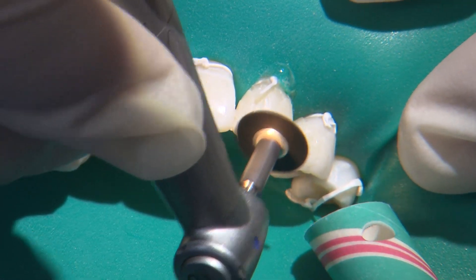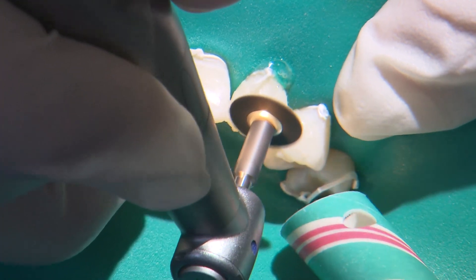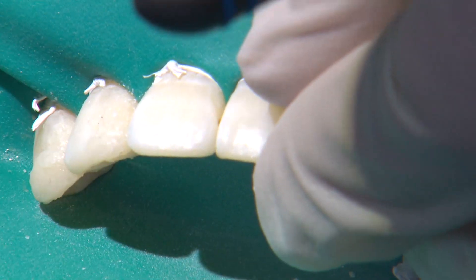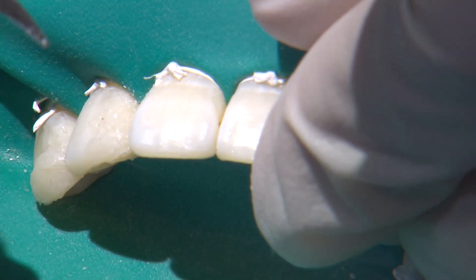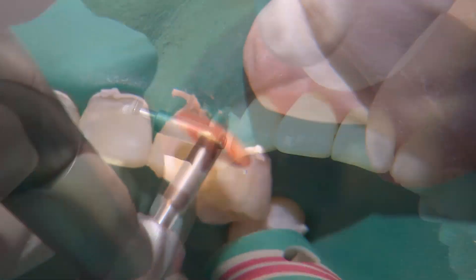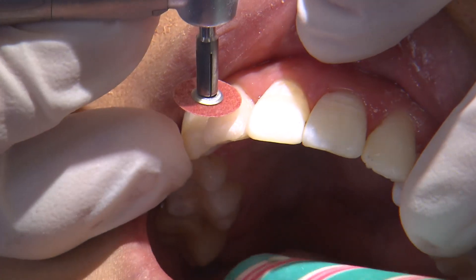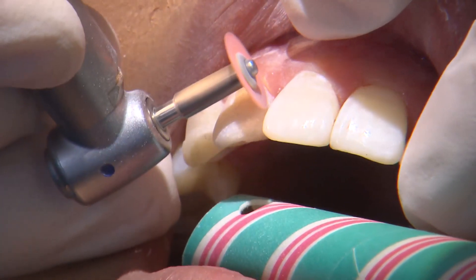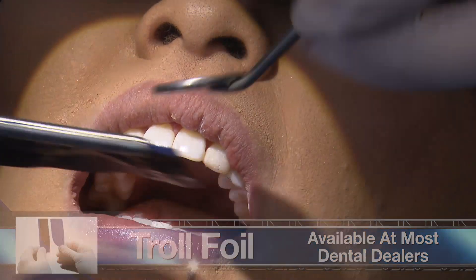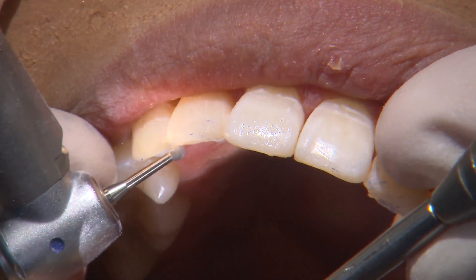The next time I have a similar case, I will definitely do that step at the beginning rather than wait until the end, because leaving it longer can interfere with the seating of the putty matrix. A 12 blade is very useful to remove any roughness along the transition between the natural tooth and the resin application — any overhangs or roughness can lead to gingival inflammation. In order for this to be a healthy addition to the patient's dentition, we need to try to ensure that the margins are indiscernible. The darker colors of the soft flex discs are used primarily for gross reduction, and the lighter ones are used for refining contours and margins and removing large areas of surface roughness. Here I check the occlusion and use a slow speed round burr to adjust any high spots, which typically removes composite material with minimal effect on the enamel.